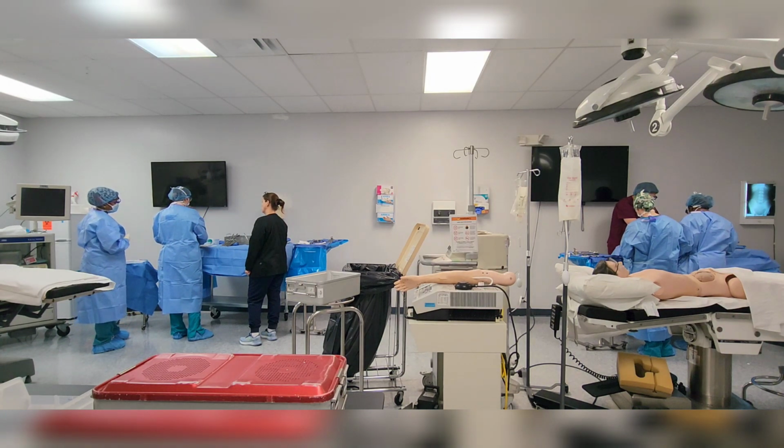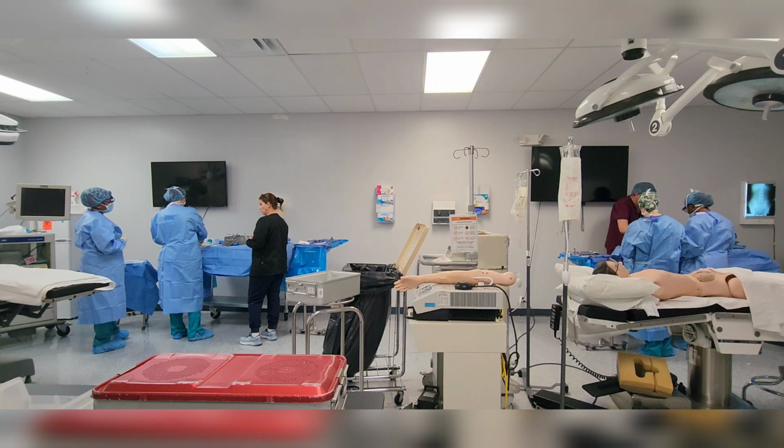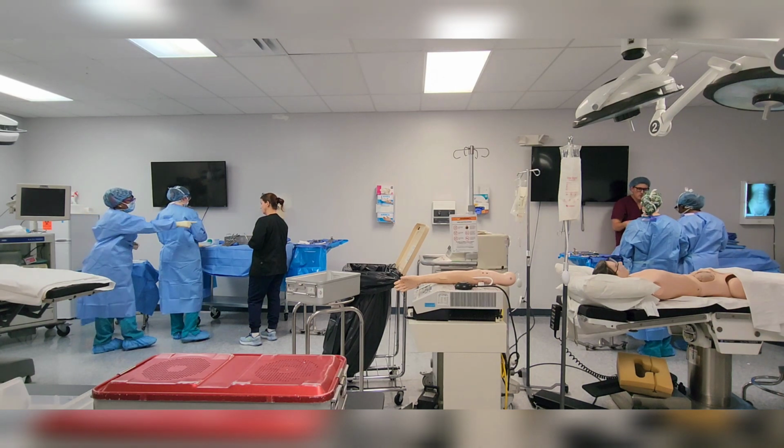So you're ready to go. If the doctor ever needs the suture, you always have something preloaded and ready to go.